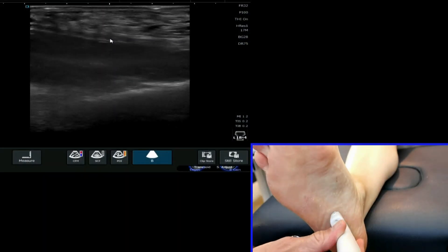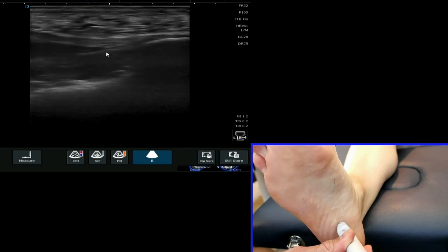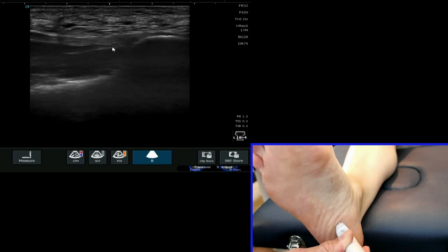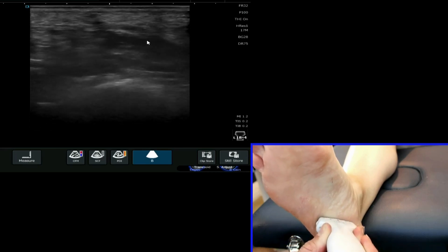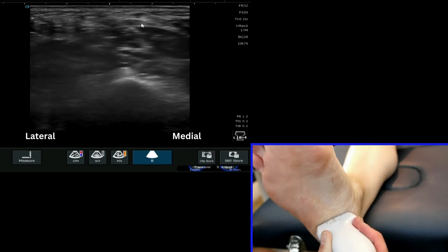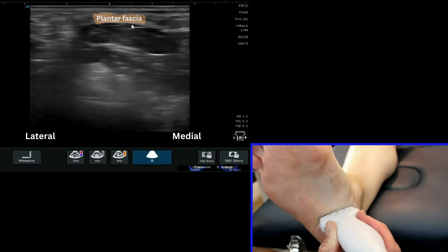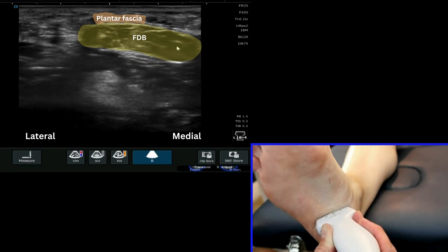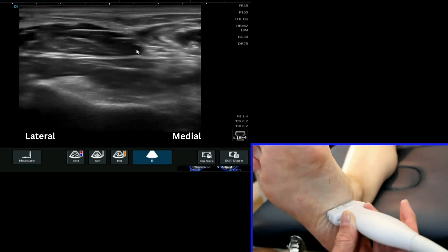We're now going to have a look at the abductor hallucis, and we're going to start off by finding that plantar fascia and that central cord again in a long axis view, getting a nice clear view of that originating off of the calcaneus — where my cursor is. I'm then going to follow that down slightly into the midfoot, spin my probe around, and glide it slightly more medial to bring the plantar fascia into view, sitting superficial to the flexor digitorum brevis muscle.